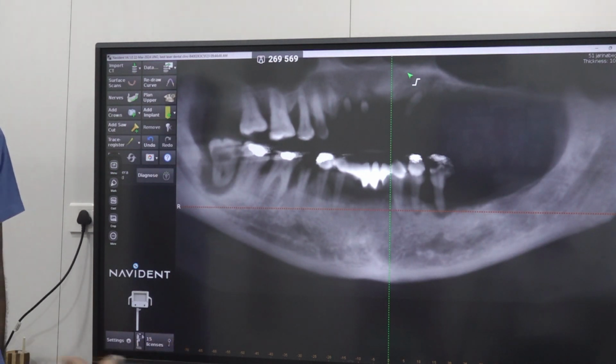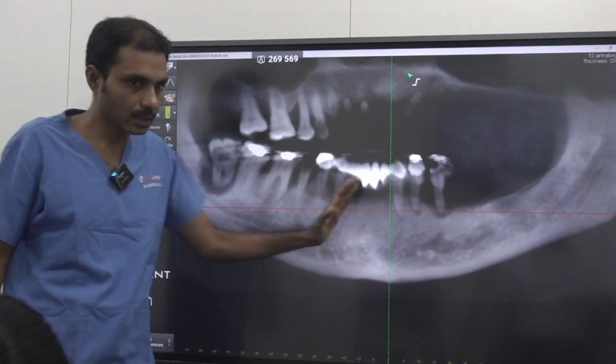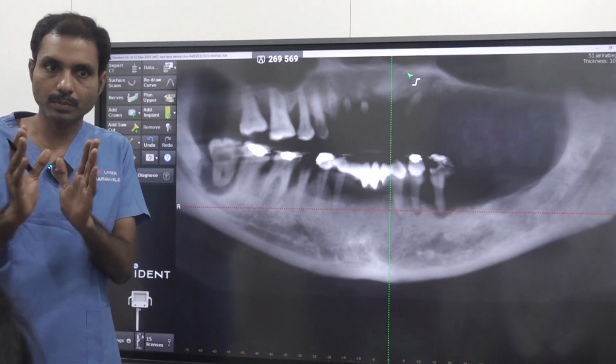If it's not a basal implant, you go for conventional. Then also you can do the same. Or you should go for a prosthetically driven implant. When you are placing the implant in the bone, make sure it is in a decent position, so that when you fix the abutment, it is in a decent position.